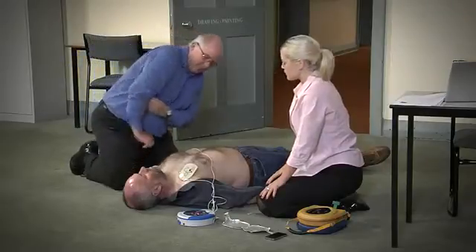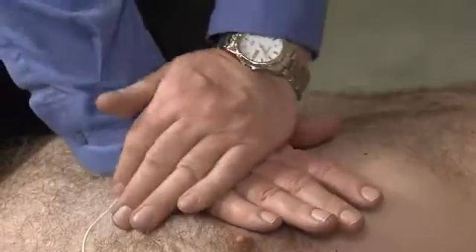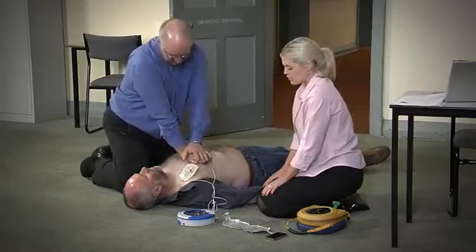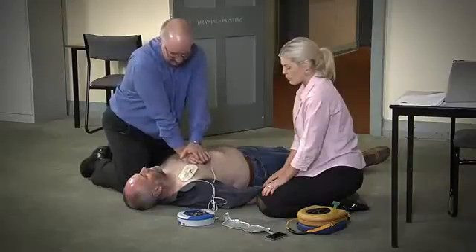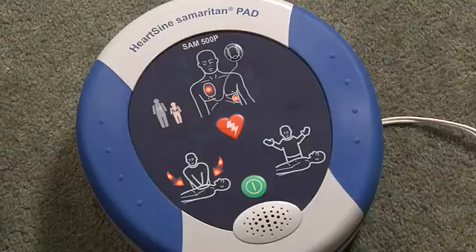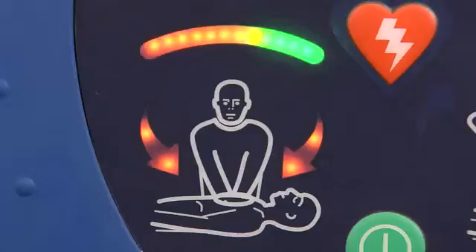It is safe to touch the patient. Place overlapping hands in the middle of the chest and press directly down in time with the metronome. Remain calm — when performing CPR, watch and listen to the AED. Push harder. It will analyze the effectiveness of the compressions.